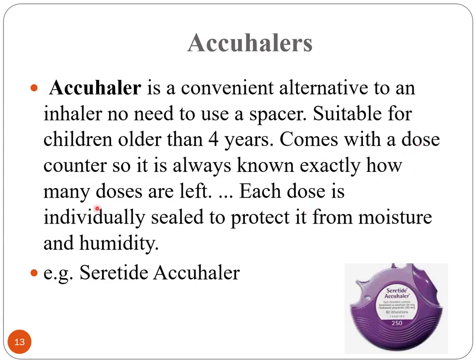It comes with the dose counter, so it's always known exactly how many doses are left, so that the patient will be notified earlier if the Accuhaler is nearly empty. Each dose is individually sealed to protect it from moisture and humidity. An example in practice is the Seretide inhaler, used for treatment of.